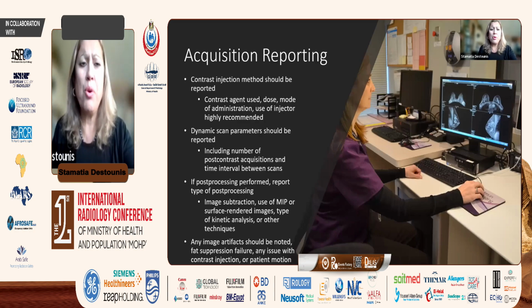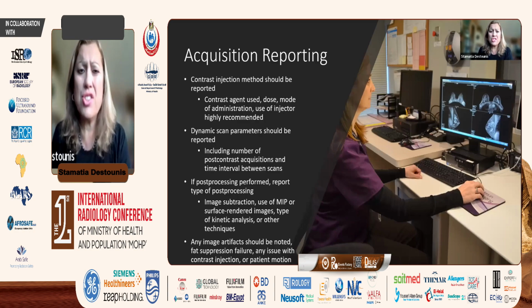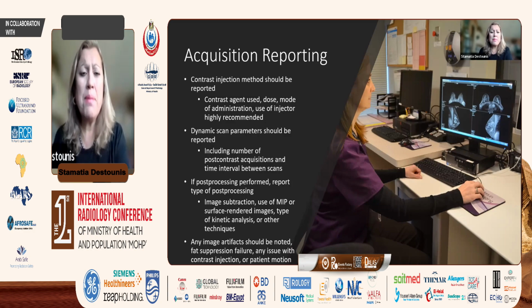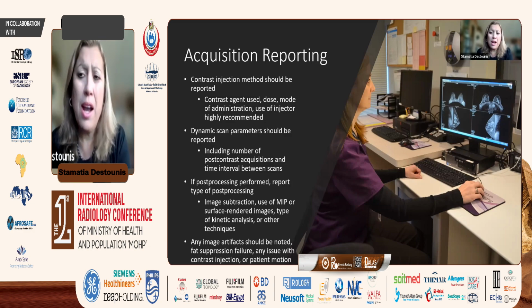Part of our reporting has to be the contrast injection and the method. So what agent we're using, how much the dose was, the mode of administration. There's a strong preference here for the injector and not to do a hand injection. The dynamic scan parameters need to be reported, how many post-contrast acquisitions we're doing and what is the time interval between each scan. If we're doing post-processing, then we have to state that.